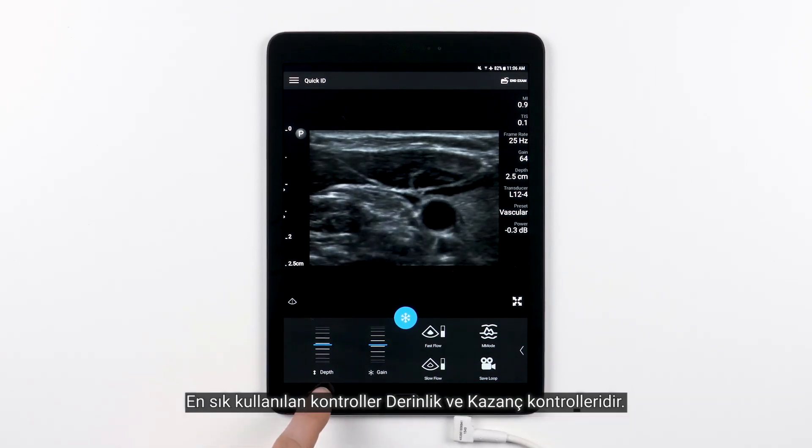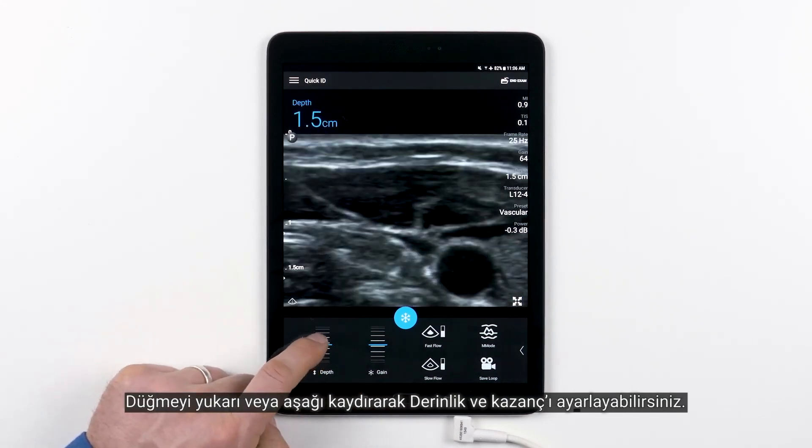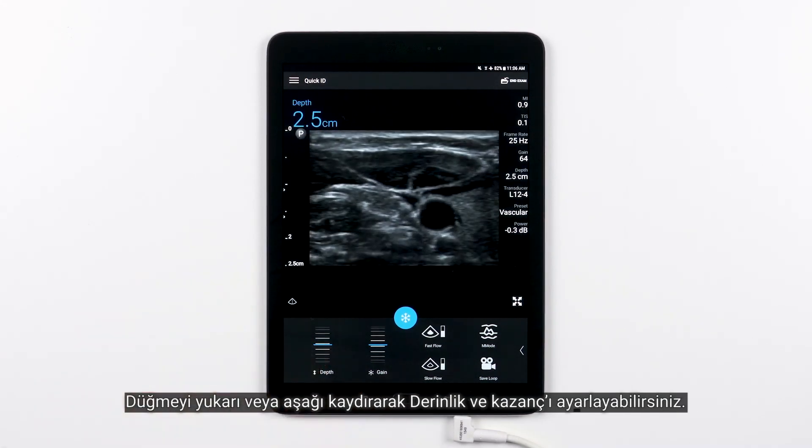The most commonly used controls are the Depth and Gain. You adjust the Depth and Gain by simply scrolling up or down over the dial.